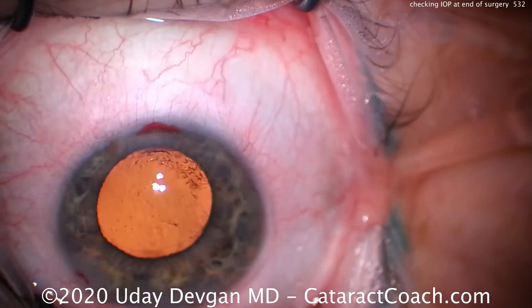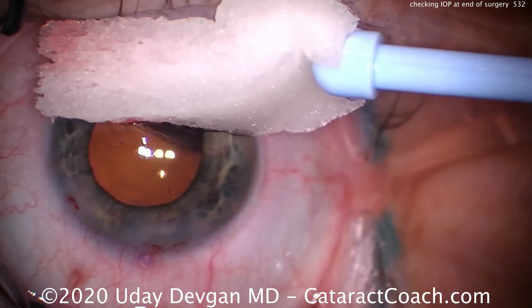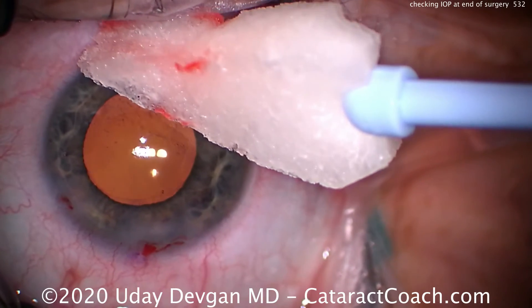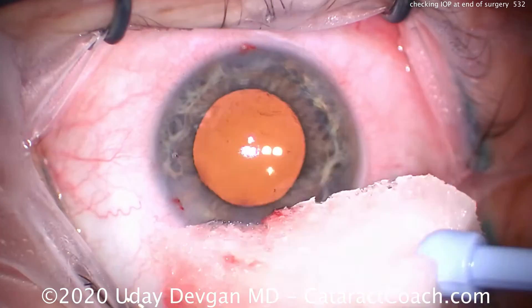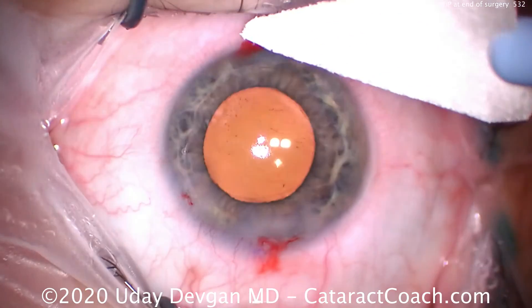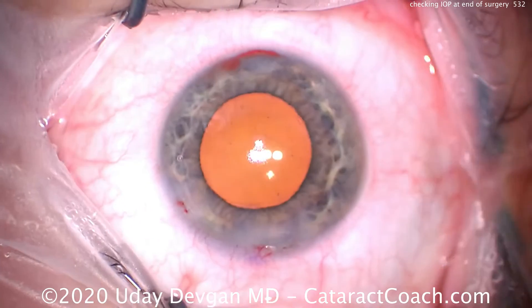If the pressure in the eye is too high — more than physiologic — it's more prone to leak. If the pressure is too low, less than 10 millimeters of mercury, there's not enough support from inside the eye pushing the incision together, and the incision will leak. These valve incisions work best when the intraocular pressure is around 20 or 25 millimeters of mercury.